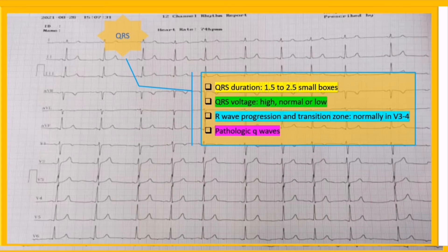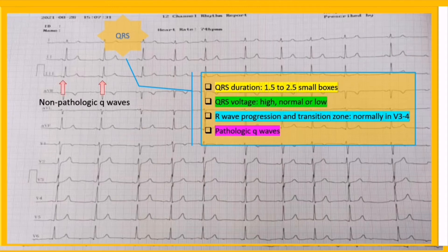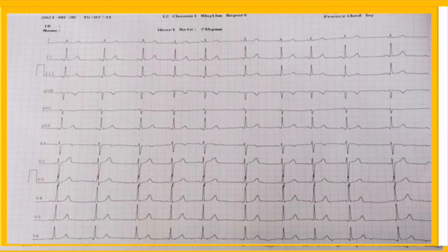Note that not all Q waves are pathologic, and not all pathologic Q waves are due to infarction. Unfortunately, there is no consensus on the definition of pathologic Q waves — we will elaborate on pathologic and non-pathologic Q waves and their differential diagnoses in future videos. In our strip, there is just a small non-pathologic Q in lead III and is of no clinical significance.